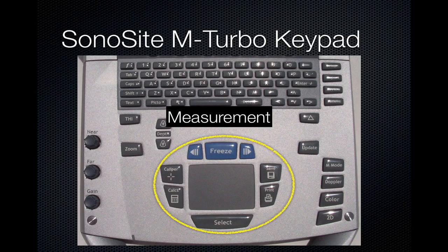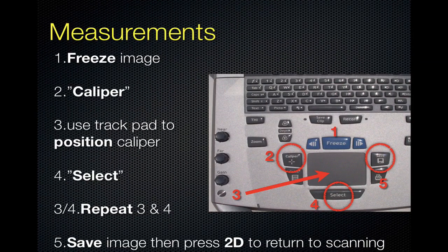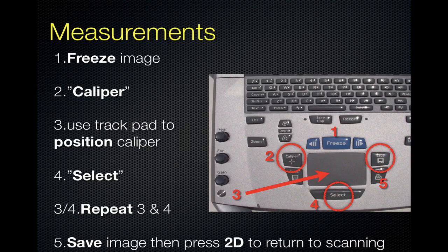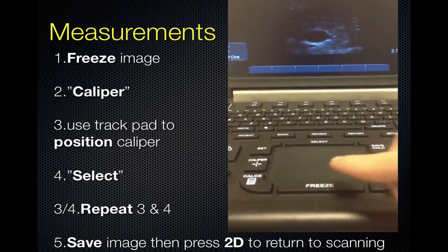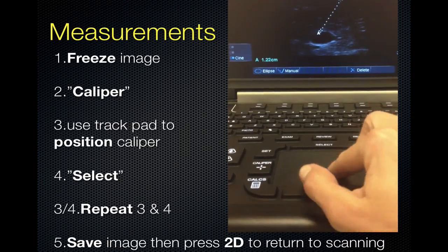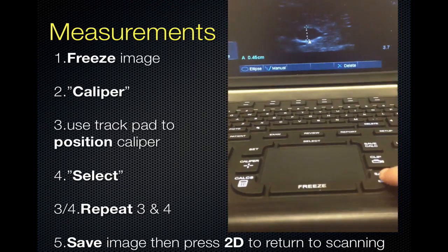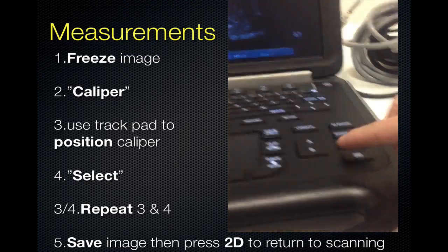When you need to measure structures with calipers, use the buttons in the middle of the field. The sequence is: first, freeze the image; then select Caliper. Use your trackpad to position the caliper on one side of the object you are measuring and hit Select to lock it in. Repeat to place the caliper on the opposite side and hit Select to lock it in. Then save the image and press 2D to return to scanning.